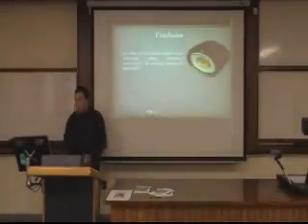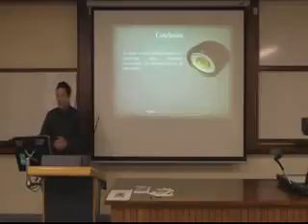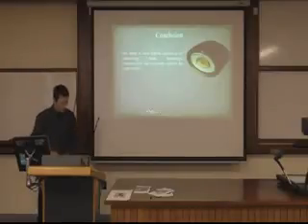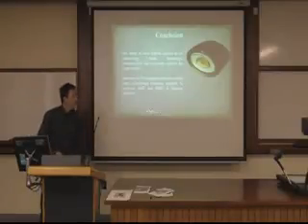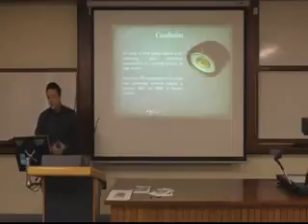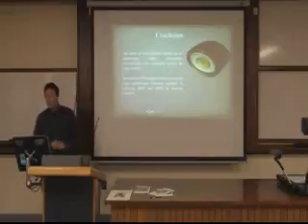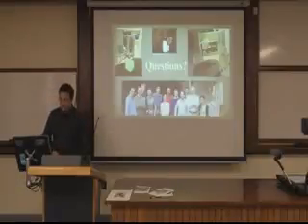And so the conclusion is the ability to track fiducial markers in arc radiotherapy using stereoscopic reconstruction can accurately account for target motion. Reduction in PTV margins used in all external beam radiotherapy treatment methods, in particular the complex ones of IMRT and VMAT, is therefore plausible. So, if there's any questions?